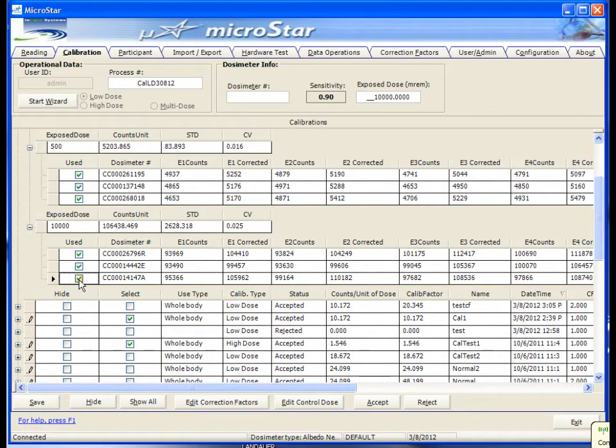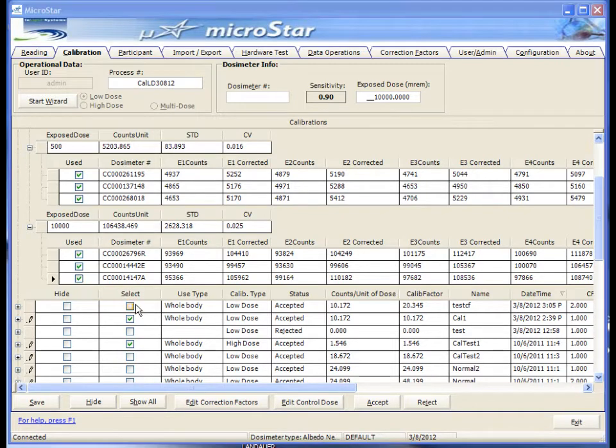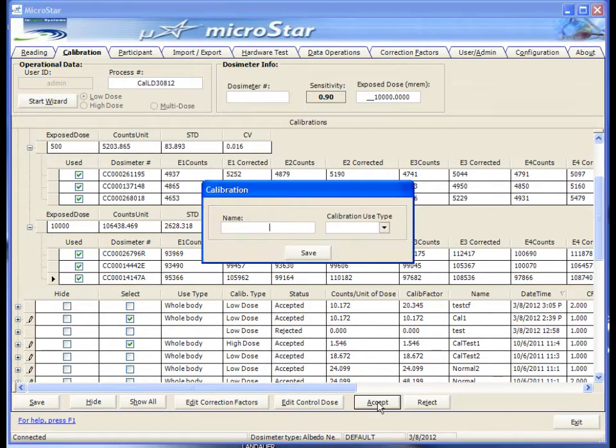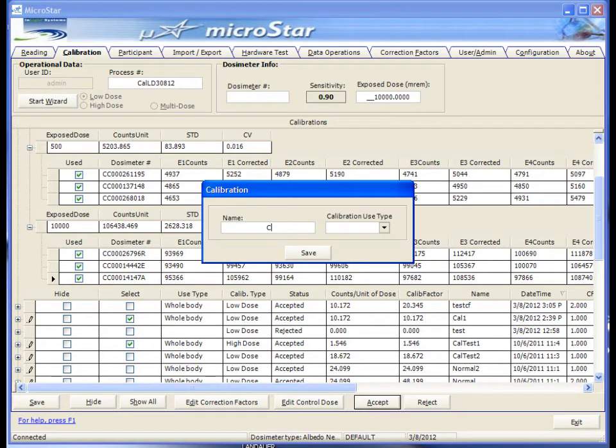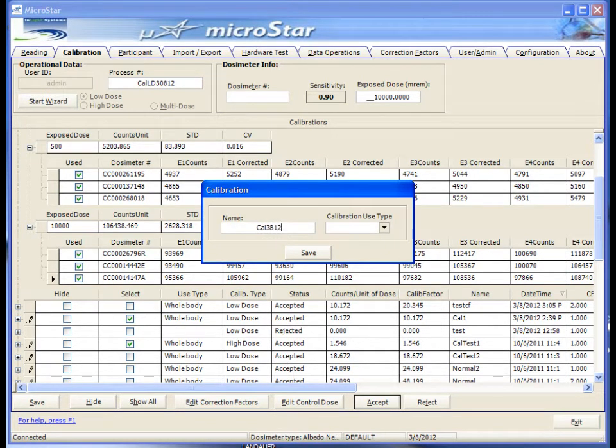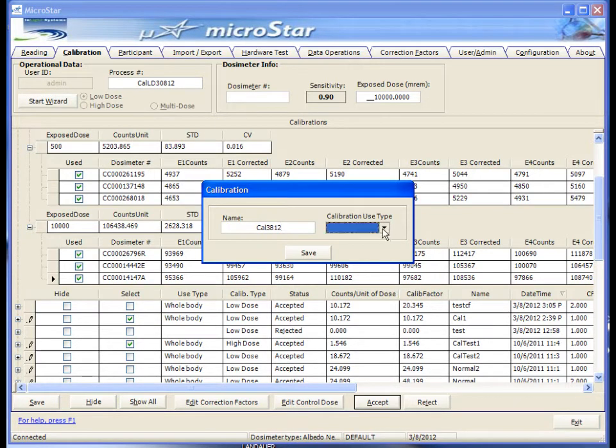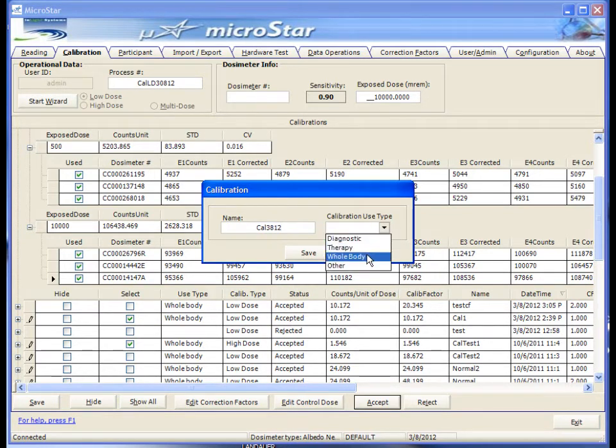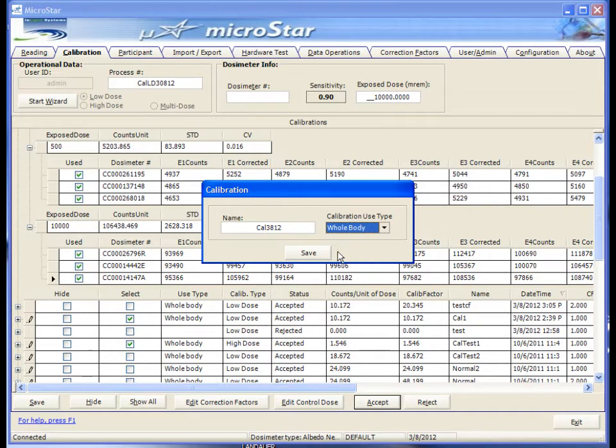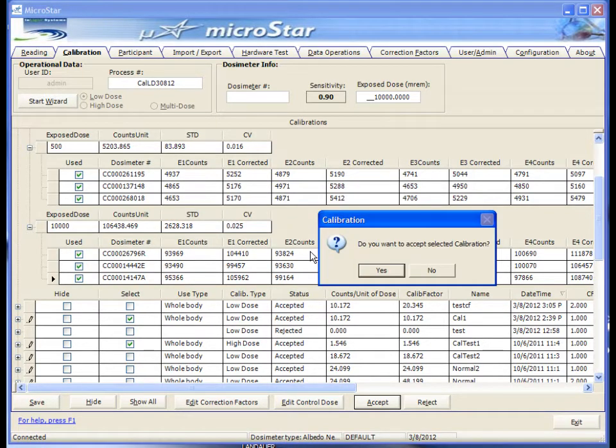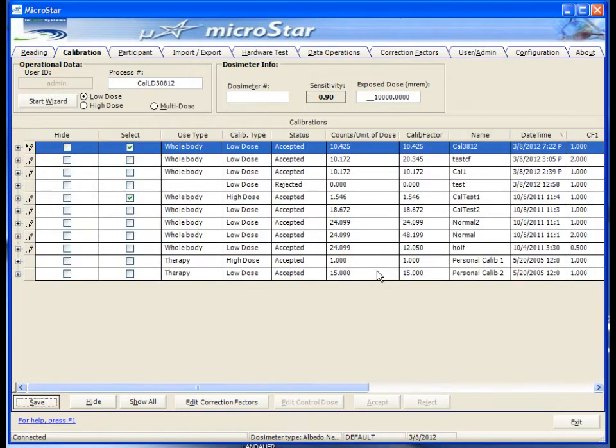Once satisfied, click the Accept button on the bottom pane to accept the calibration. Type the name you want to use for this calibration. Then select the calibration use type. Then click the Save button and Yes to accept this calibration. The new calibration will be displayed on the calibration grid.